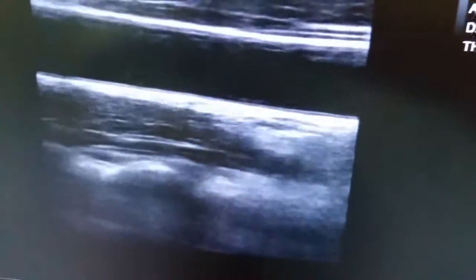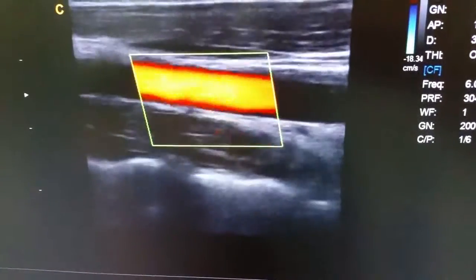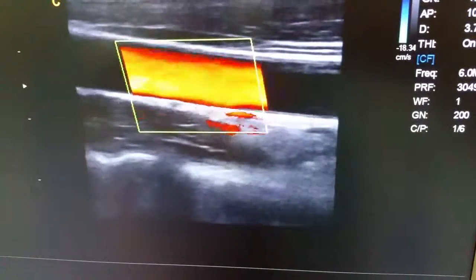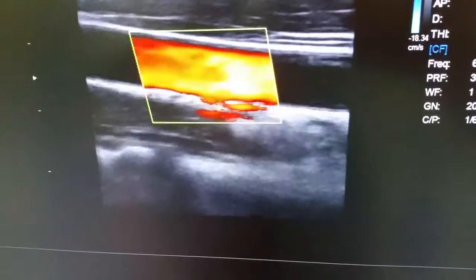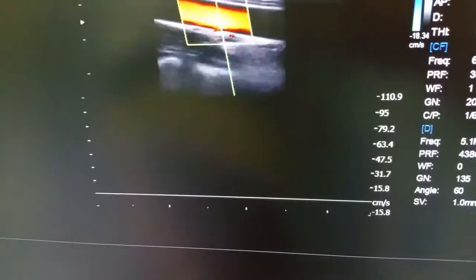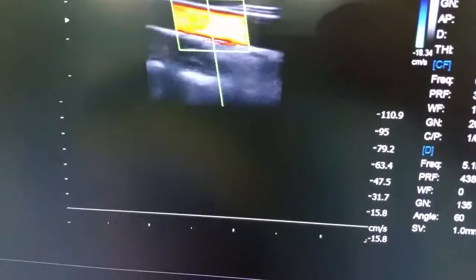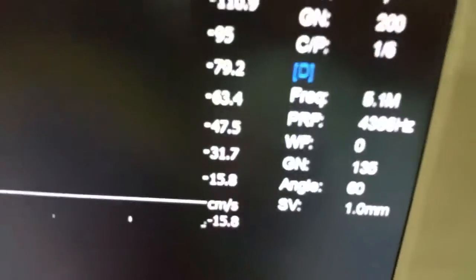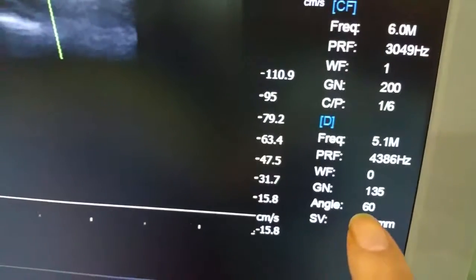We'll put on the color and move the color box to the right place using the top remote. Going to the top — Doppler mode.